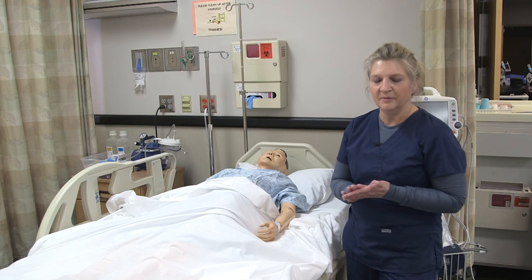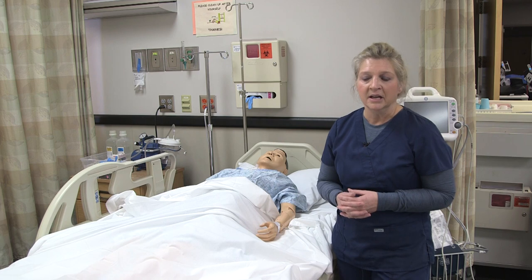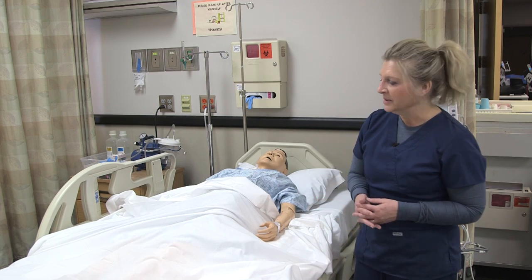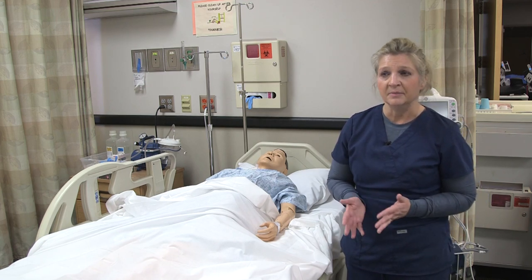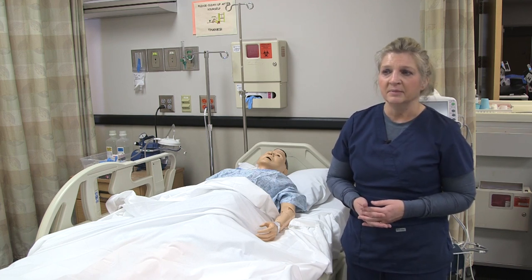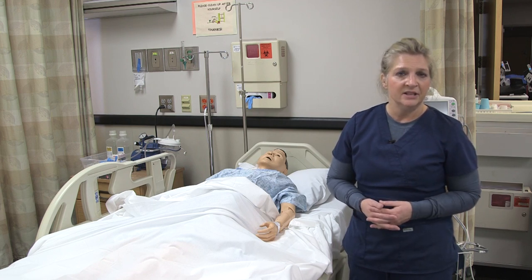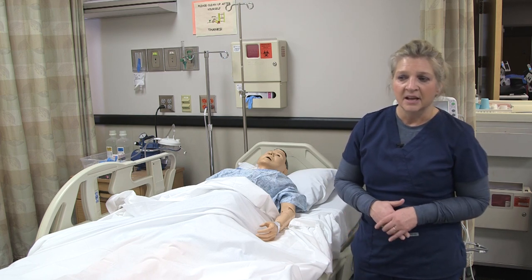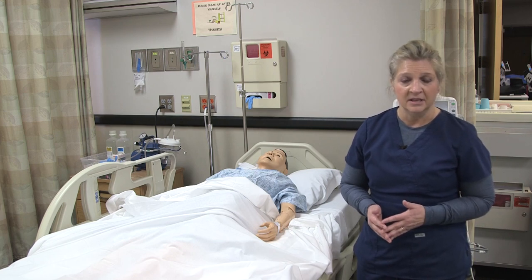I've verified my order from my provider that the patient needs to have telemetry monitoring. There are several indications for telemetry monitoring. One of the indications could be that the patient comes in with an irregular rate or some dysrhythmias and the provider wants to monitor those, or perhaps they're having some cardiac medications where we do need to monitor them while we're giving them. I'm going to show you now how to place a telemetry monitor on a patient.